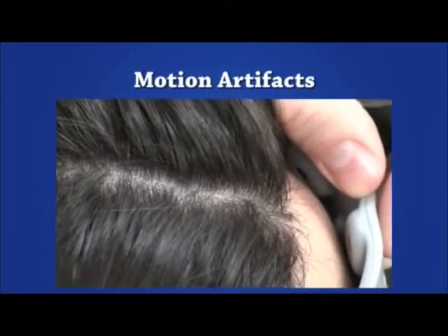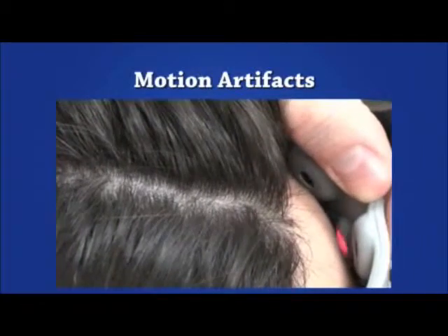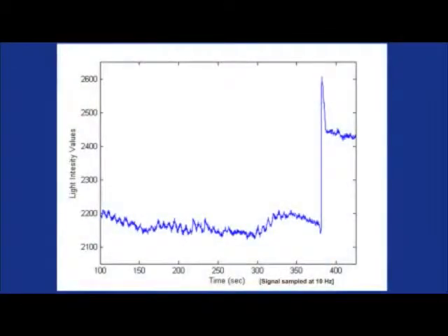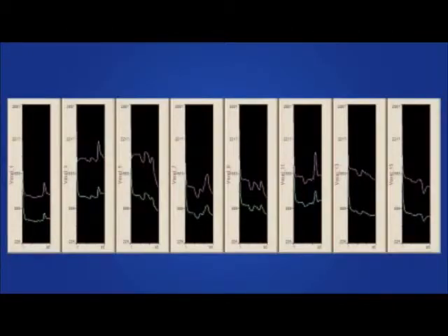Similar saturation effects may happen if the detector pops and loses contact with the skin, causing ambient light to leak. Head movement can further cause changes in the pressure applied to the sensor pad or to the light sources and detectors. These changes may allow more photons to enter into the tissue, thus temporarily varying the detected light intensity. Other than just visually inspecting the data for possible motion artifacts, there are a growing number of motion artifact detection and removal algorithms to automate the process and eliminate subjectivity.